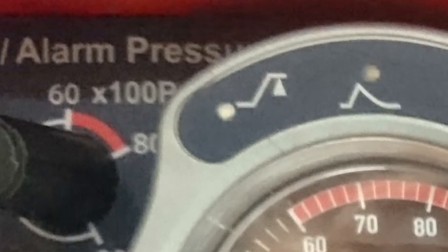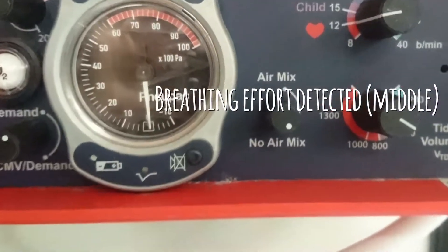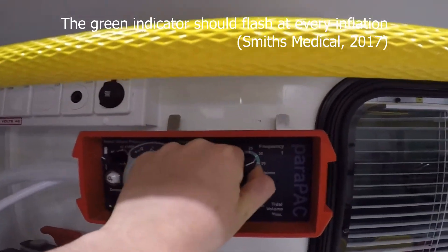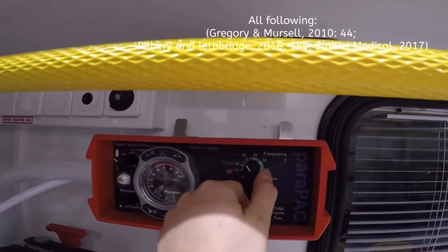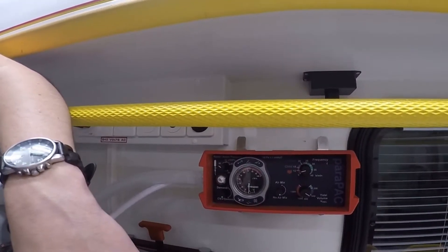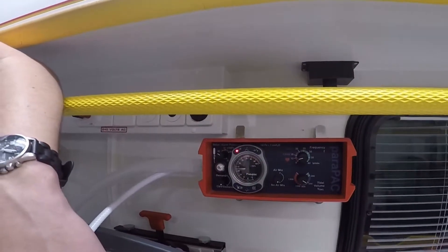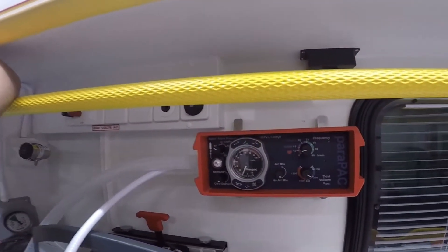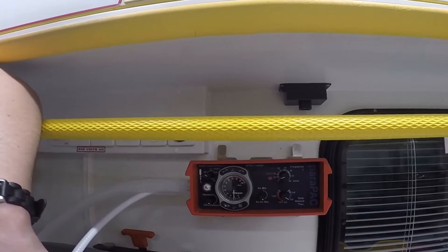Top left is the high pressure alarm. Top right is low pressure. Bottom left is battery indicator. The middle one tells you when breathing is detected by the ventilator. High pressure means excessive tidal volume, incorrect airway position, kinked ET tube, or incorrect ventilation settings. If the pressure is reaching its max, there may be something wrong with the circuit; if you've checked the above and the alarm is still sounding, Smith's Medical advise that your tidal volume setting might just be too high. Low pressure means leakage, insufficient tidal volume or settings, or a faulty valve in the patient's circuit. This alarm tends to occur when pressure drops below 10 centimetres of H2O.